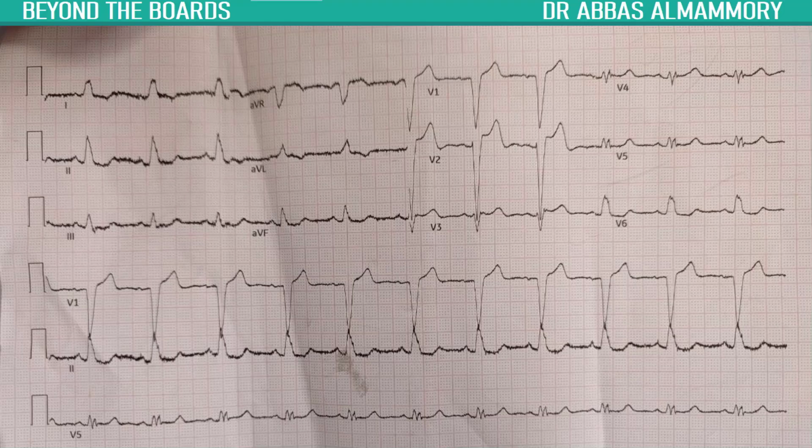The first thing that I want to start this video off with is what one of our highly astute cardiology professors has always told us, and that is there is no spot diagnosis in the ECG. You always have to look at the patient and take the clinical circumstances into consideration, and then interpret the ECG as such. At the end of the day, you want to treat the patient, not just the ECG.